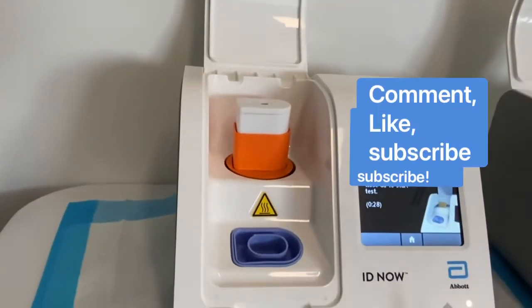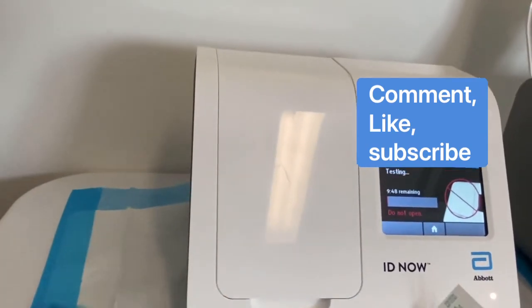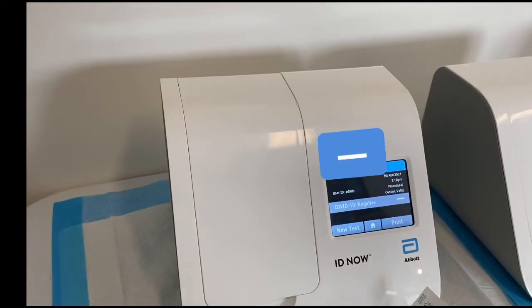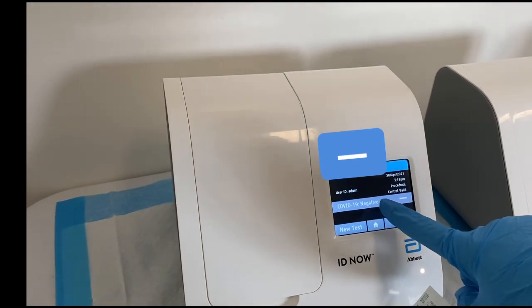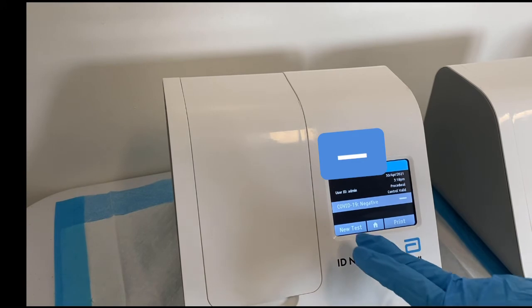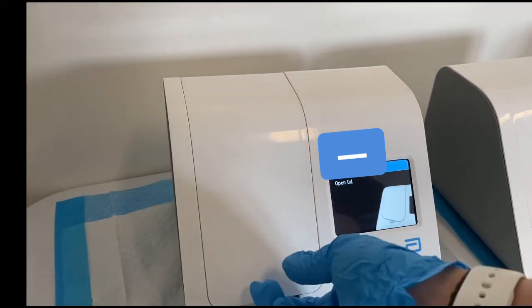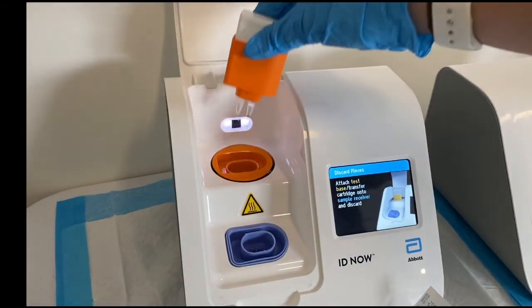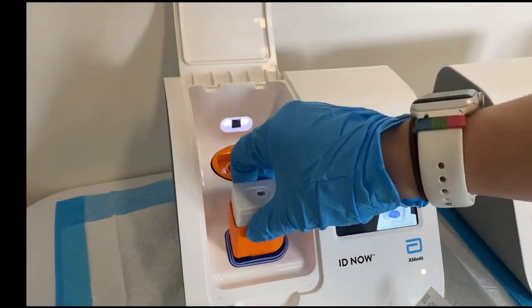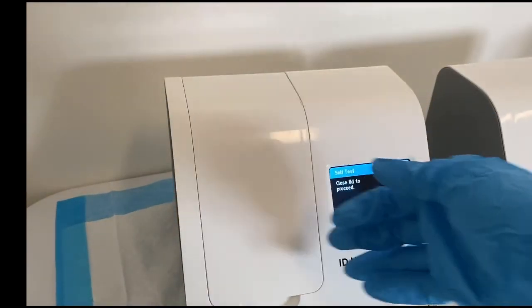It will then tell you to close the lid, and you have about 10 minutes for the test to run. If there's something wrong with it, it will say invalid. Otherwise, it will come up like this — which is negative. Simply open it, take the base out, click it into the fluid chamber, run the self-test, and dispose accordingly.